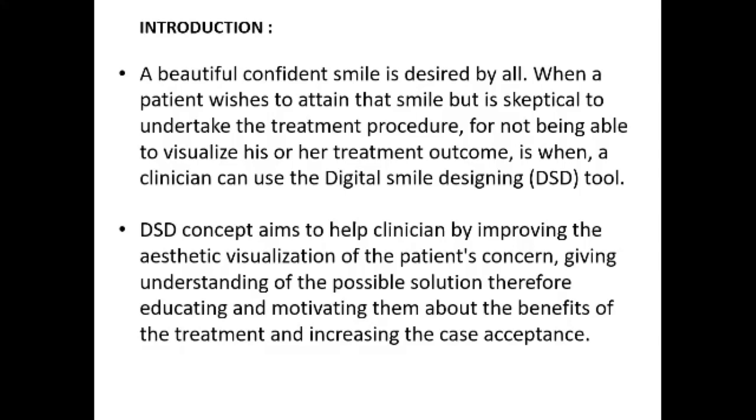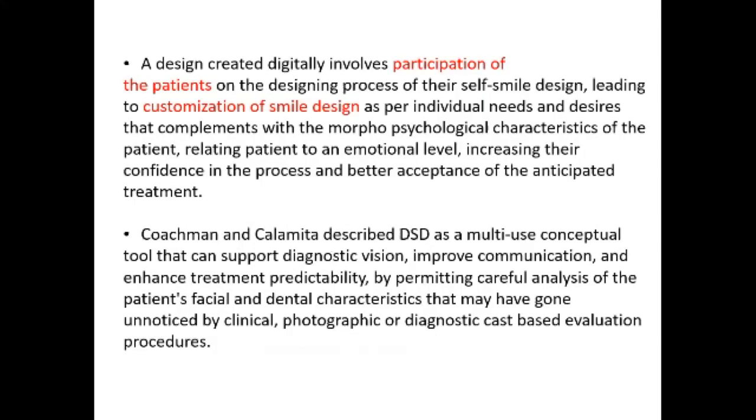This DSD concept aims to help the clinician by improving the aesthetic visualization of the patient's concern, giving understanding of the possible solution, therefore educating and motivating them about the benefits of the treatment and increasing the case acceptance. As I told earlier, it helps in active participation of the patient, which could help in customization of the smile design as per individual needs and desires.